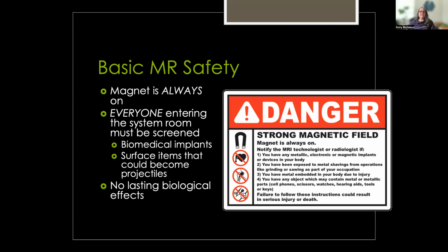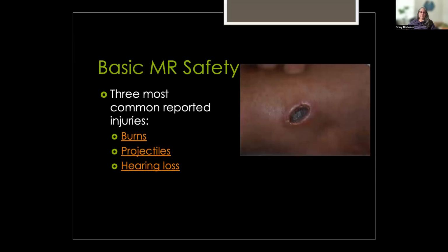If there's a projectile that may unfortunately cause trauma, that could become a deadly incident. But when we use the MR system properly and practice proper MR safety procedures, there are no lasting biological effects. And so that makes us one of the safest modalities when used properly.